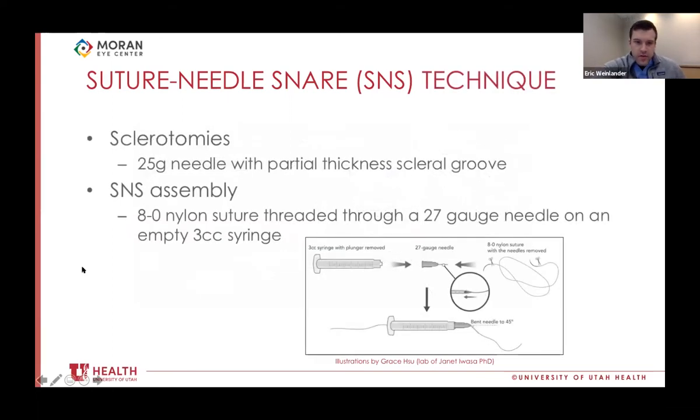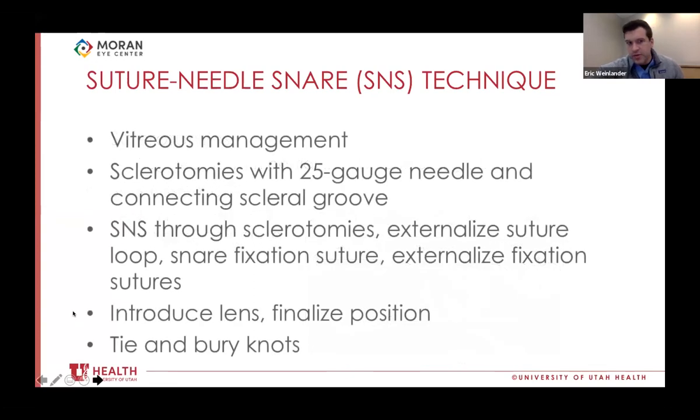We pair this device with a 25-gauge needle sclerotomy connected by a partial-thickness scleral groove. The 25-gauge size is the smallest that can accommodate a Gore-Tex knot, and we feel that architecture is the most self-sealing and least traumatic. The general approach is still based on the same principles: vitreous management, making sclerotomies, introducing the means of externalizing the fixation suture, introducing the thing being fixated, then finalizing position, tying, and burying the knots.